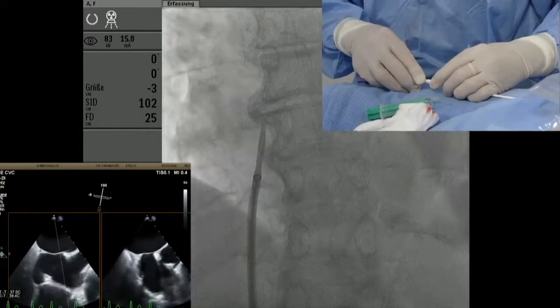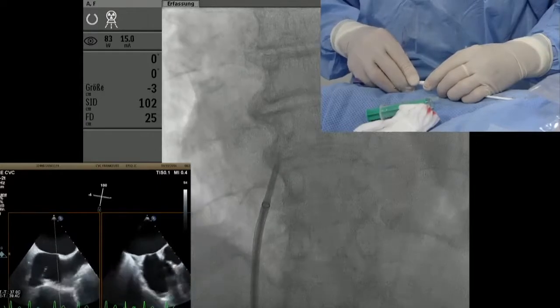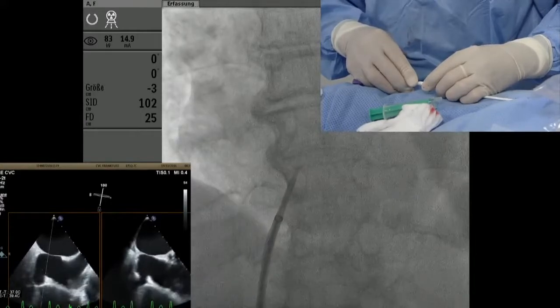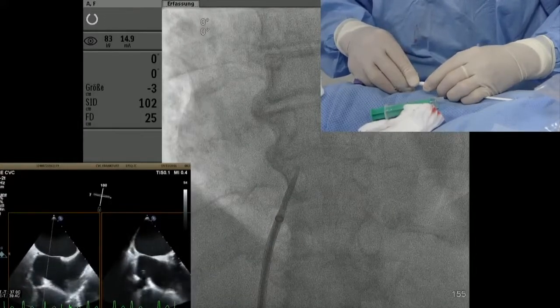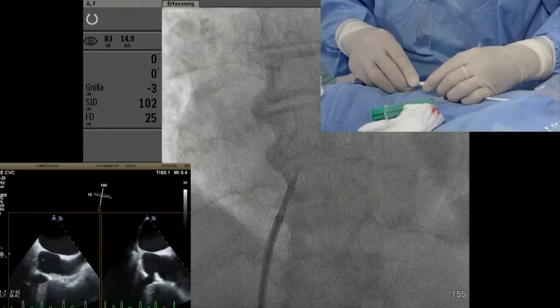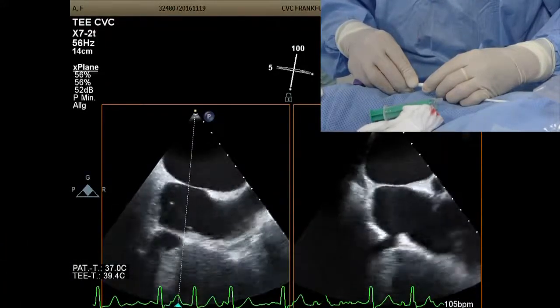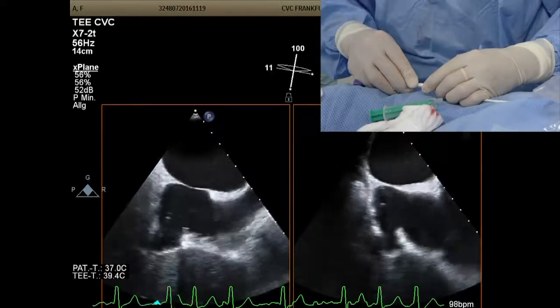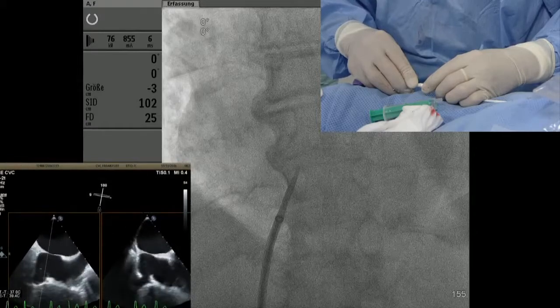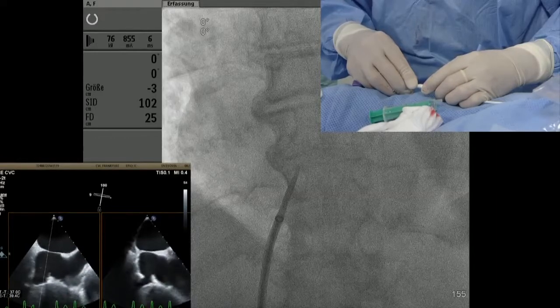So now you see again the tenting at the fossa ovalis and coming down. Lost again? Wow. There's still a little tenting. You see it on the short axis. It's in the posterior area of the septum, and we are in the inferior area. So is that a good position to puncture? What do you think? Peter, are you happy? Well, as long as we don't know which device we use, we can choose a special point for transeptal puncture. But it should be inferior and posterior, I think.